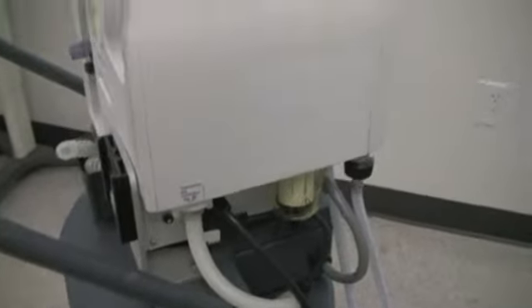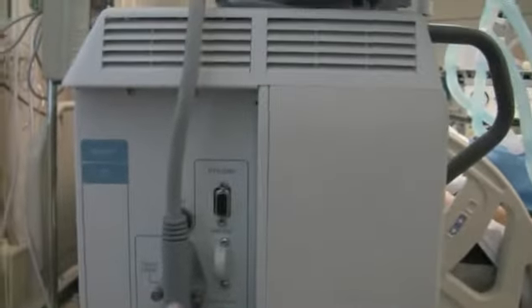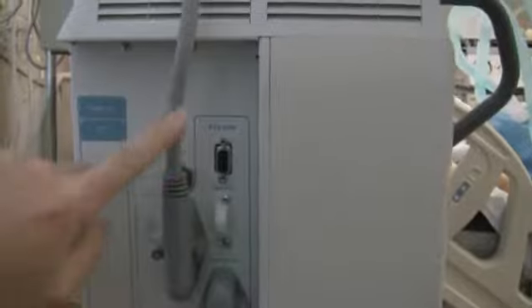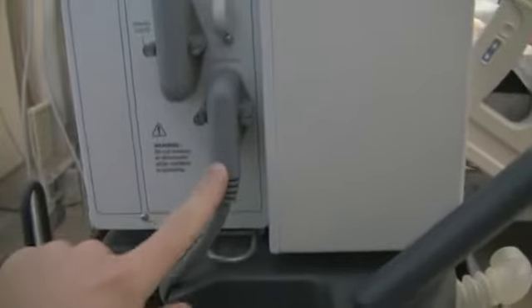Over on the left panel, we'll see here, much like our other machine or the 7200 that had everything on the back, this one has it all on the left panel. We have our display that's running here and up into the back of our main panel. We have another cord here and that runs down to our compressor on the bottom. This will control it if it needs to be kicked off or on.